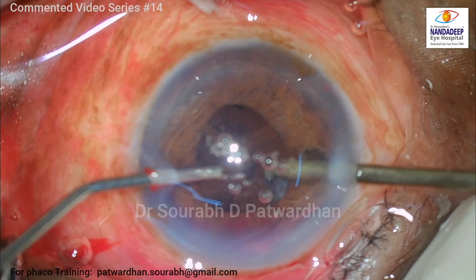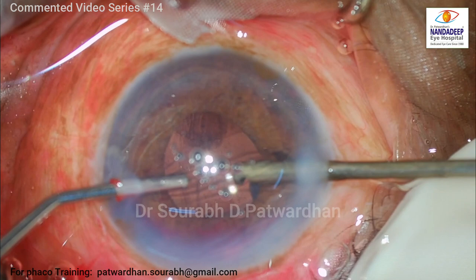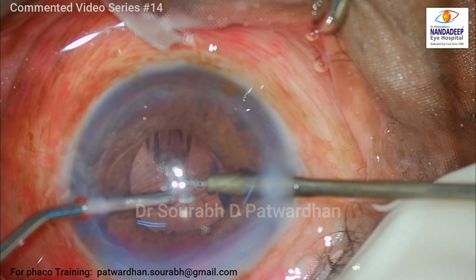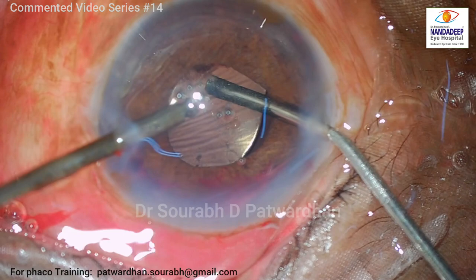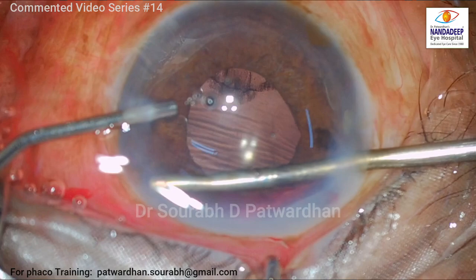During this procedure, I noted that there was some membranous kind of structure. I thought it might be vitreous or something else, but I realized it was remaining cortex — the cortex had remained from the first surgery. So I just aspirated it out using the vitrectomy probe. I am also washing off some blood which had gone into the bag.